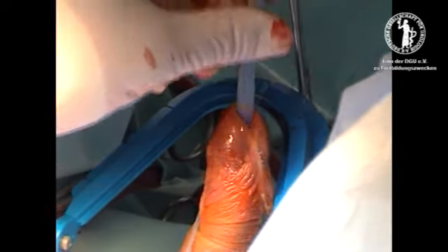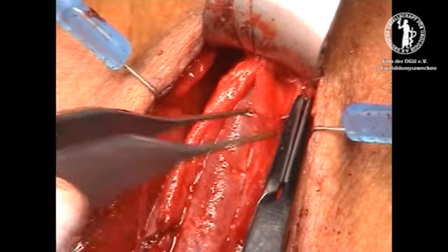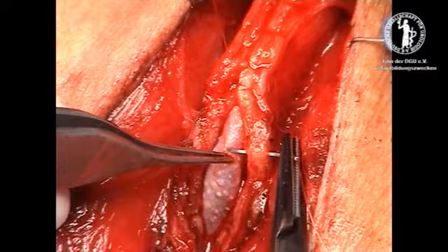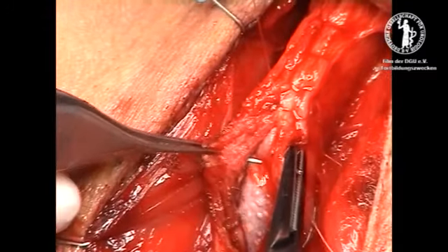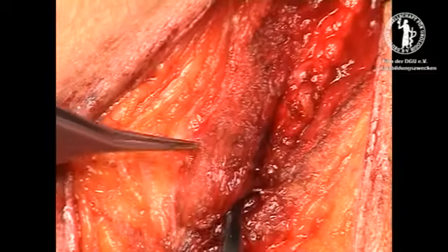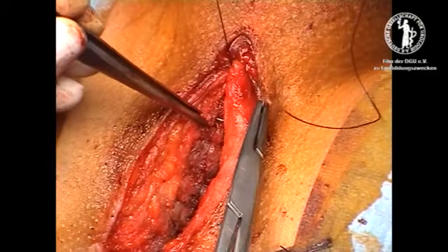A 18 French silicone catheter is inserted for 3 weeks and the graft is covered by the corpus spongiosum by 4-0 Monocryl. Closure of the wound by running sutures 4-0 Monocryl and 2-0 Vicryl.